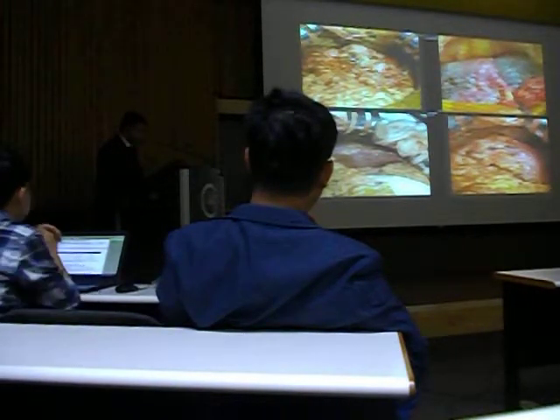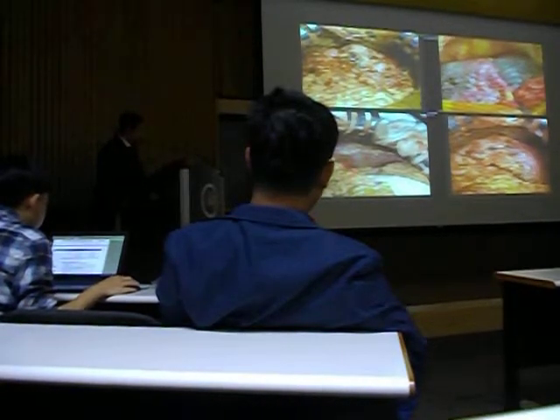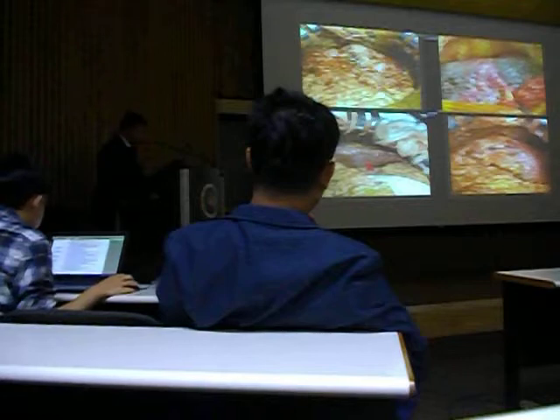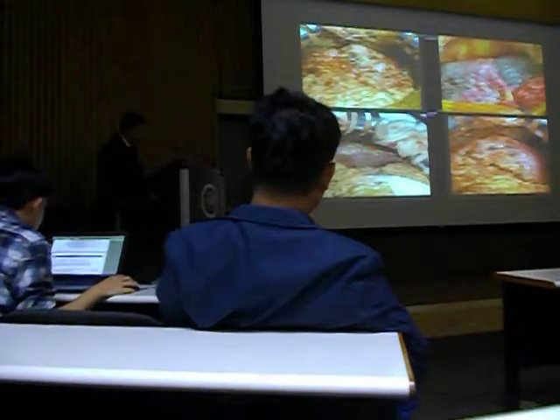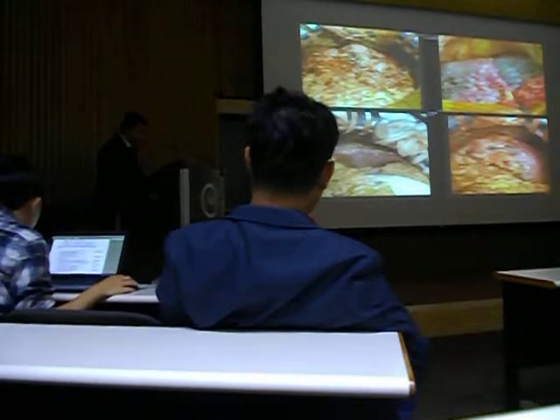This patient also had a Kasai procedure. There were extensive adhesions in this area, not very obvious in this picture. This patient has a prior LDLT and came with extensive adhesions. You can see the raw surface again. This patient had a right hepatectomy and came with extensive adhesions.